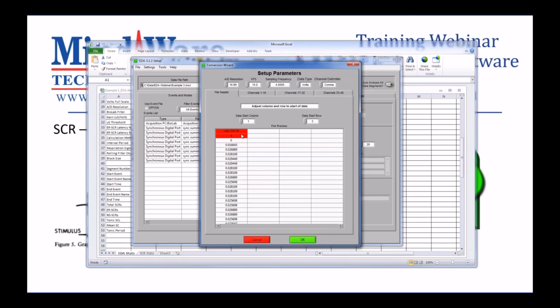And just from knowing how the Empatica file is stored, I know that this 4 here means that the sample rate is 4. This is going to be different for every device, so it's important when you're doing this to get as much information about how the data is stored as possible so that it makes bringing the data in as easy as possible. If not, most of this is defined in manuals or something that's provided by the company that makes the product.